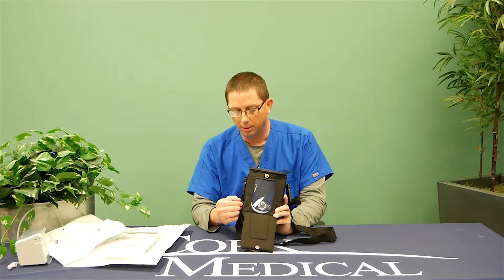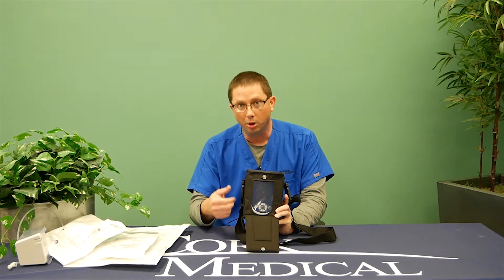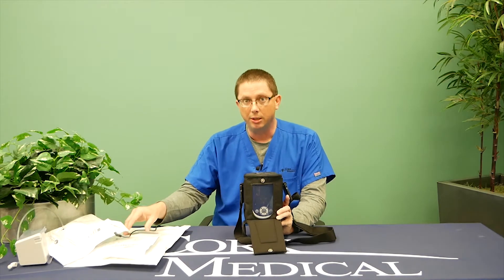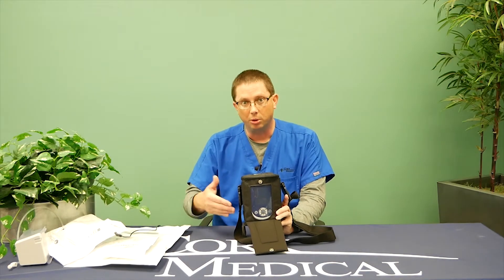If you need to get up, go to the store, or walk around, you can just unplug it and set the charger to the side. When you come back and sit down or lie in bed, you can charge the pump again at that time.